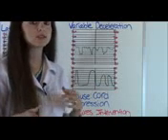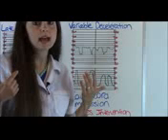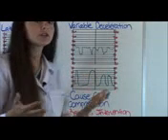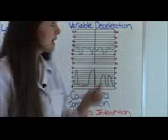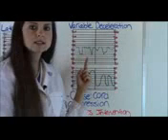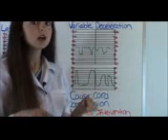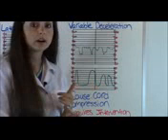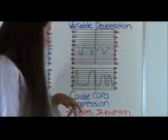What happens is either your cord is maybe prolapsed, it's wrapped around the baby's neck, or it's being compressed up against something. And when the baby turns or the uterus contracts, it decreases blood flow to the baby. So that's why you see these drastic drops. And this is not good. Always you need interventions. So remember, the two decelerations that you need to intervene on are variable and late. The only one that's normal is early deceleration.